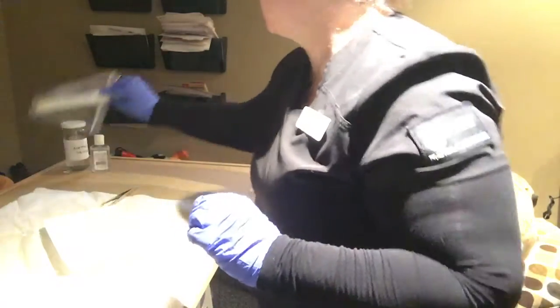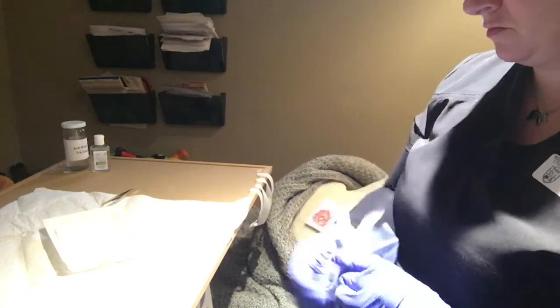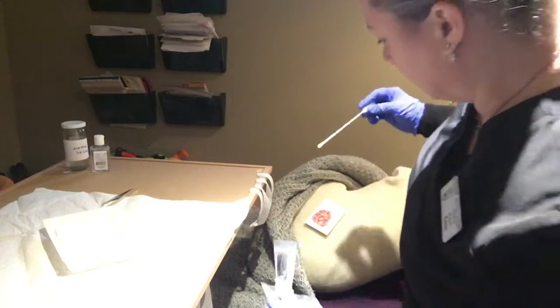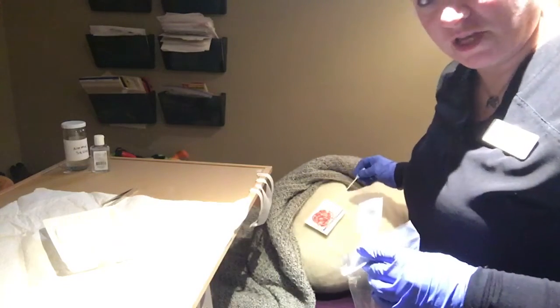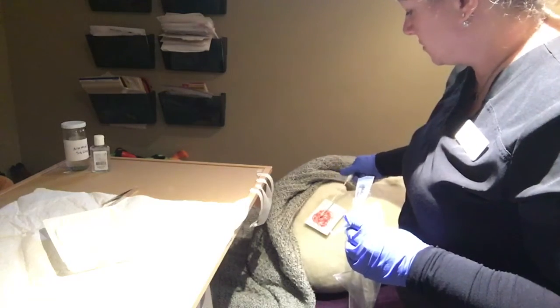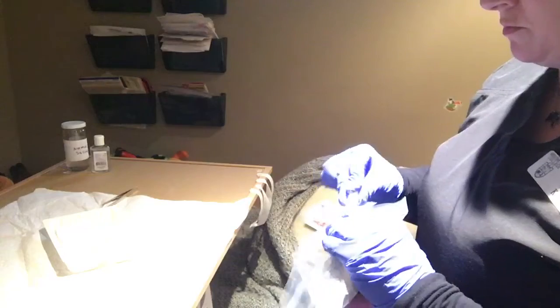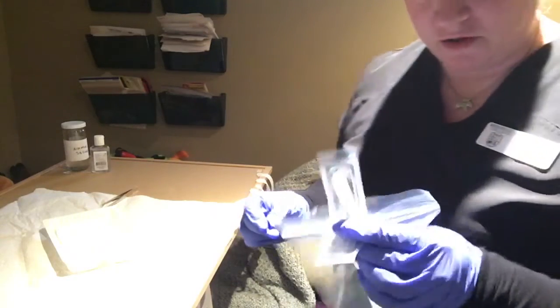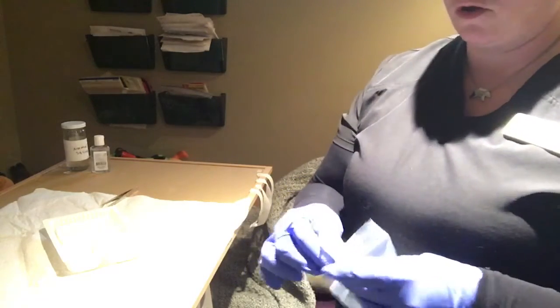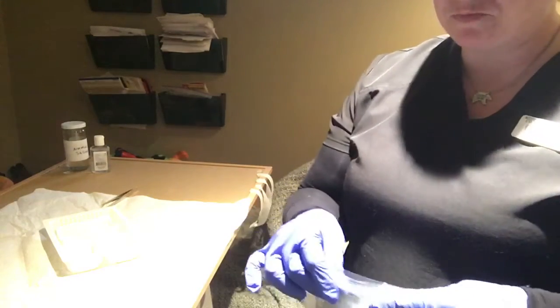I'm going to take my swab now. And with taking swabs, we want to take from the center of the wound, okay? I'm just going to roll it just enough to get a good sample, okay? Place it in the tube that it comes with. Always put it back and keep it in the biohazard bag.